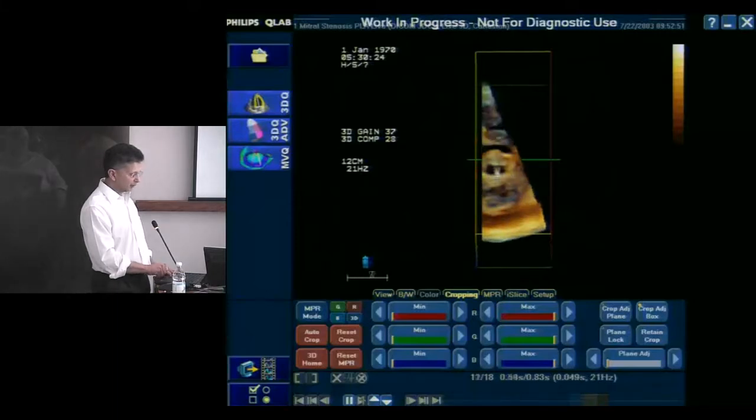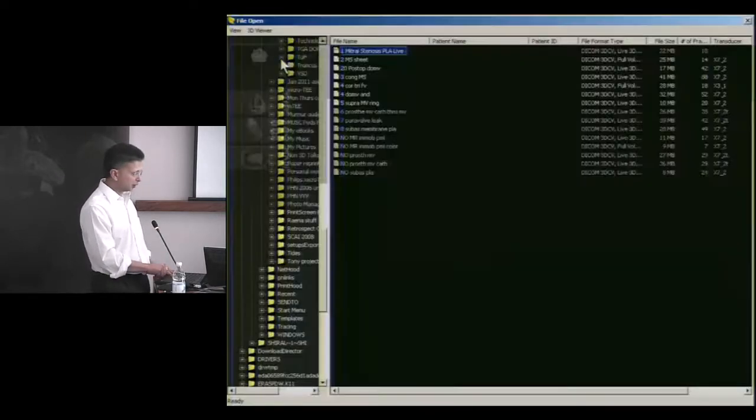That's looking at it from above, right there. So there's the orifice of this mitral valve. All of this is the posterior leaflet. It is just completely immobile. This valve opens like a monocusp valve.